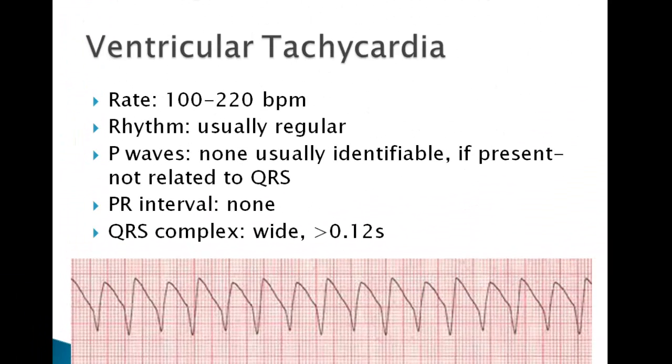They also refer to it as shark fins. Just look for that wide, repeating, similar-looking QRS complex. That's going to have a rate greater than 100, and it makes you think ventricular tachycardia.